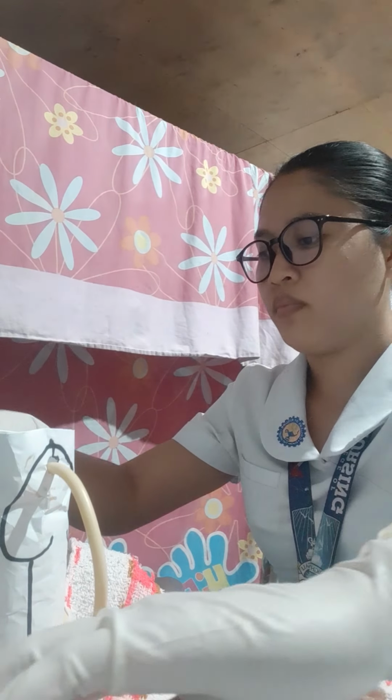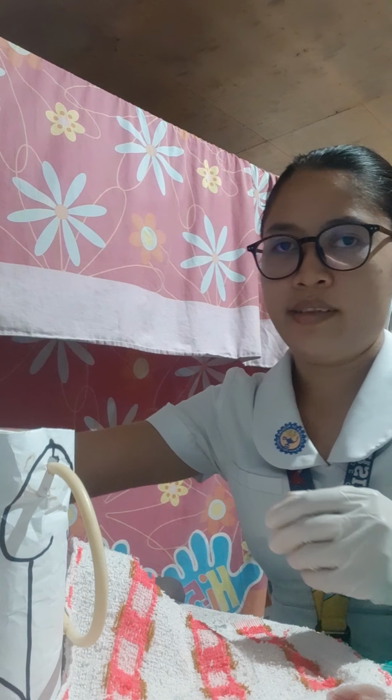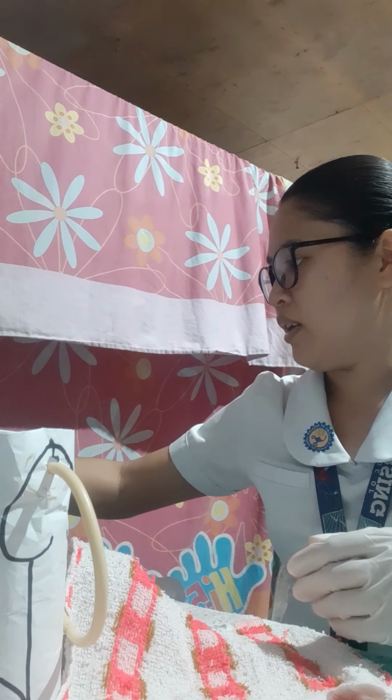Next, pour antiseptic solution on cotton balls and swabs, and apply antiseptic ointment on cotton balls to check the patient for allergies to the antiseptic.